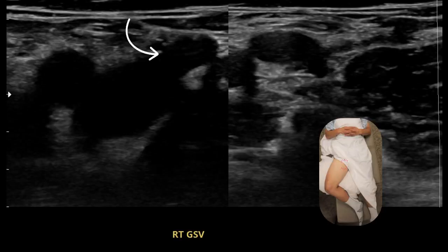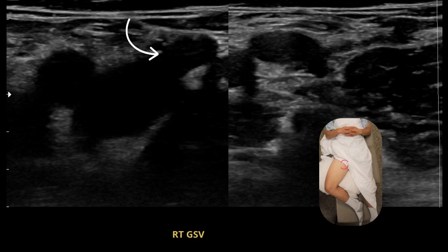The arrow is pointing to the greater saphenous vein, or the GSV for short. The GSV is coursing upward on the screen, so you know that is the GSV. Like all veins, it is going to be compressible if there's no clot present. The GSV is going to be around the groin area — it can vary per patient, but as long as you're in the groin area, you're looking for a GSV that's compressible and coursing up on the screen.